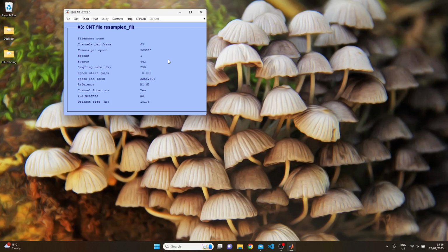Although you should obviously ensure that the data you collect is as clean as possible, all data will have periods of noise because participants are only human. Give them a break in a testing session and they'll almost inevitably make more noise than you thought humanly possible in the space of 30 seconds. So we need to remove these breaks between your experimental blocks.